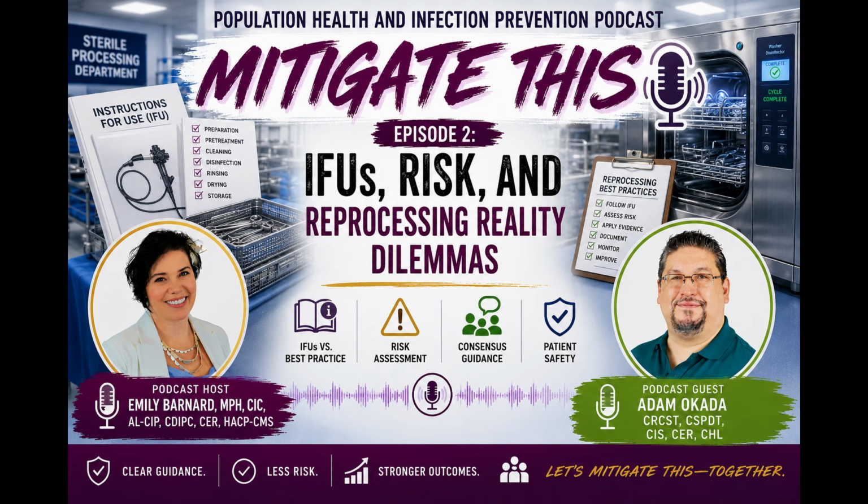And then when we get into sterile processing, we're finding problems. Especially with complex devices, think robotics, arthroscopic shavers, any of the flexible scopes, any of those devices that are very, very complex, you're going to see issues because the usage and what we are seeing in sterile processing may not match what the manufacturers were showing to the FDA.